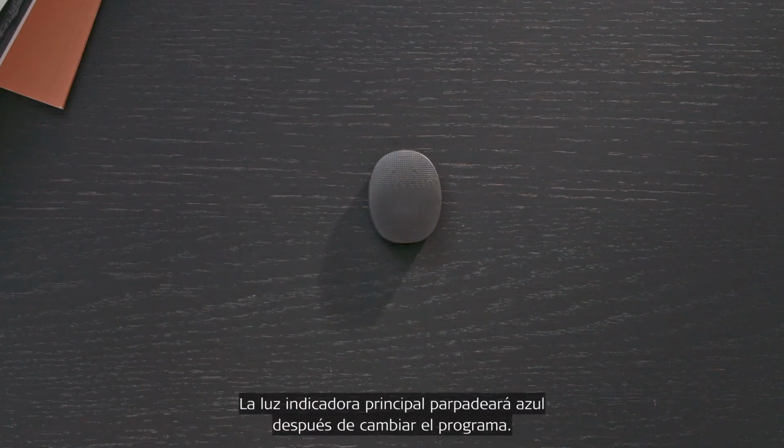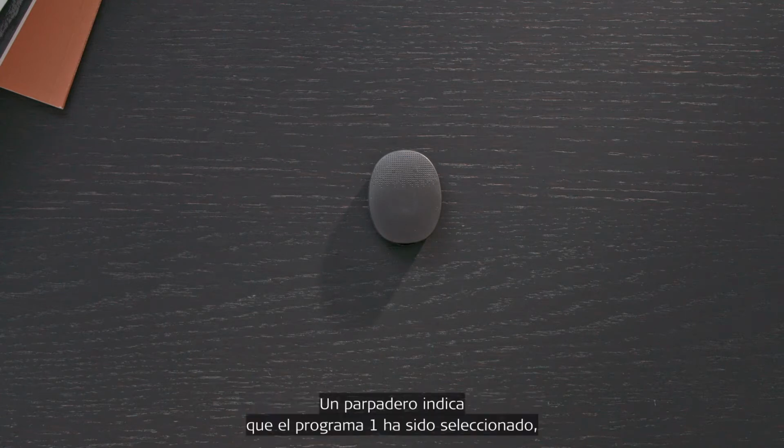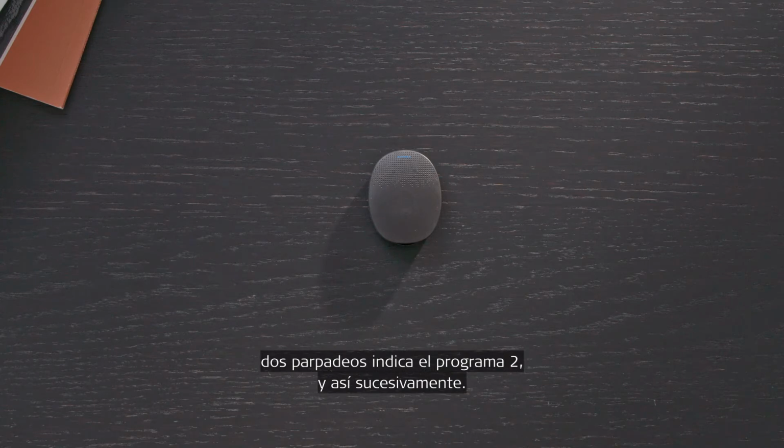The main indicator light blinks blue after changing the program. One blink indicates program 1 is selected. Two blinks indicate program 2, and so on.